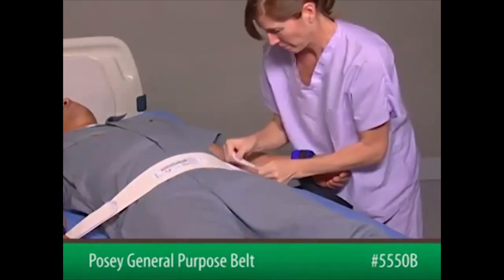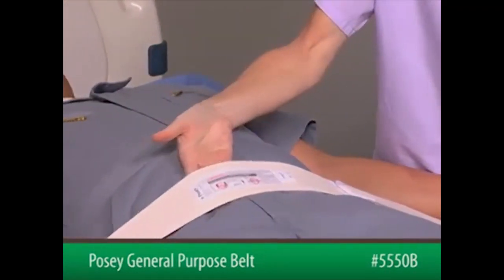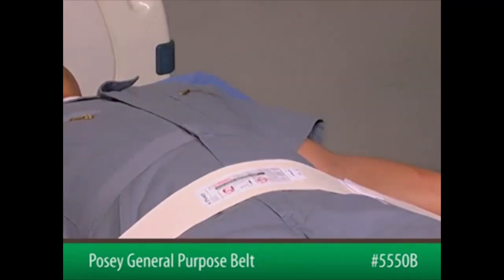To check for proper fit, slide an open hand flat between the belt and the patient. The belt must be snug but not interfere with breathing.